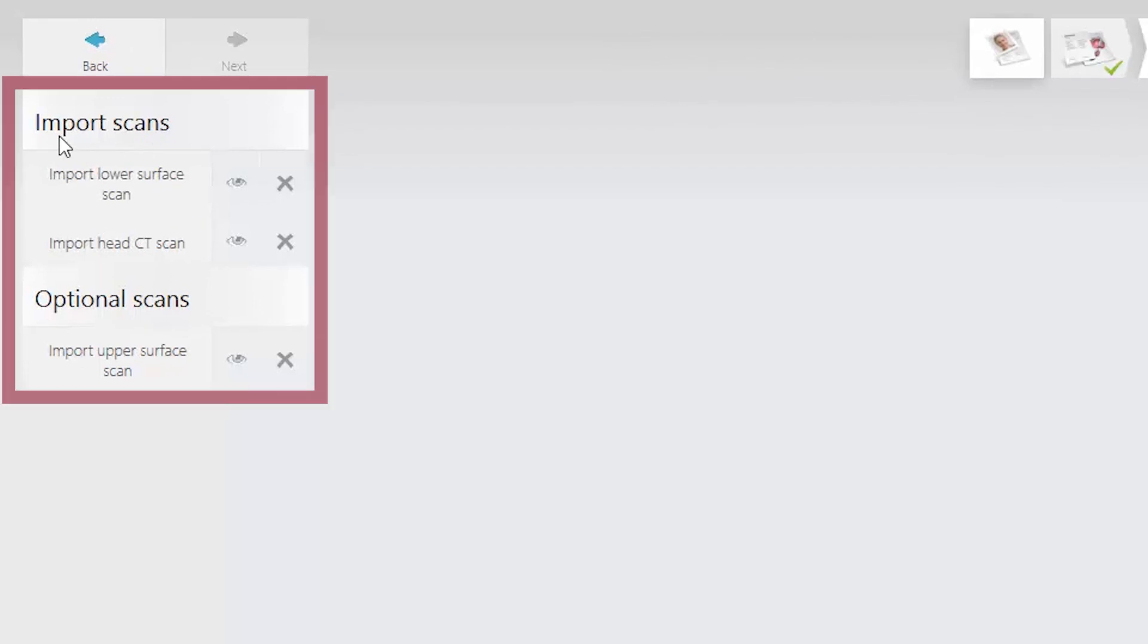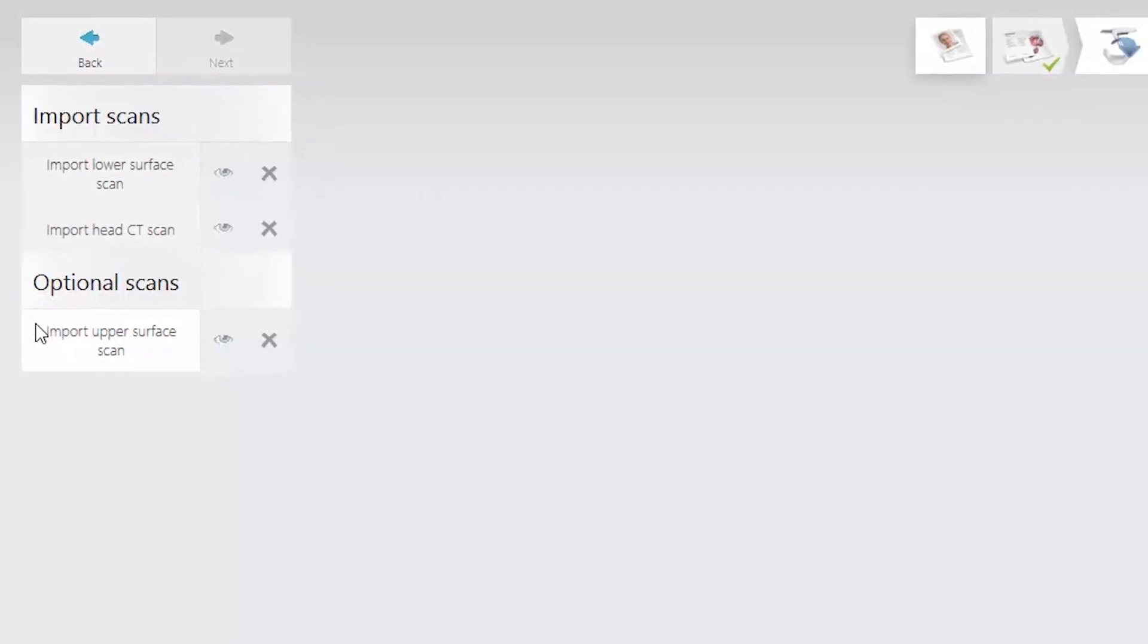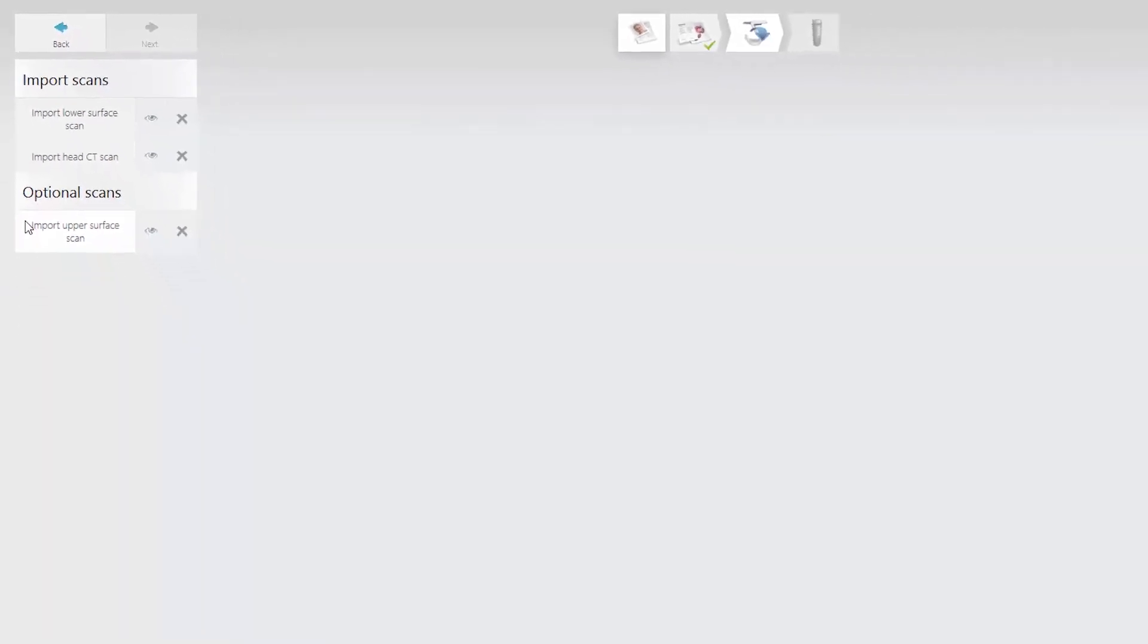On the Scan Import page, you are required to load a surface scan from the lower jaw and a patient CT scan. It is optional to load the antagonist surface scan.